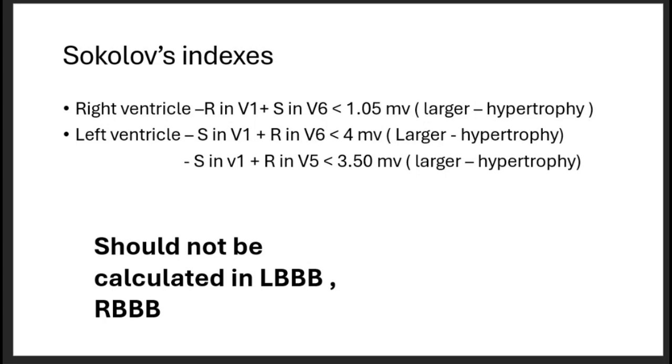So before we go on to the next slide, maybe think about the reasons for left ventricular hypertrophy. I know this is not part of the ECG test, but sometimes, if you go to Professor Kuba, he likes to ask such questions. So, 10 seconds just to think about what could be the reason for left ventricular hypertrophy.